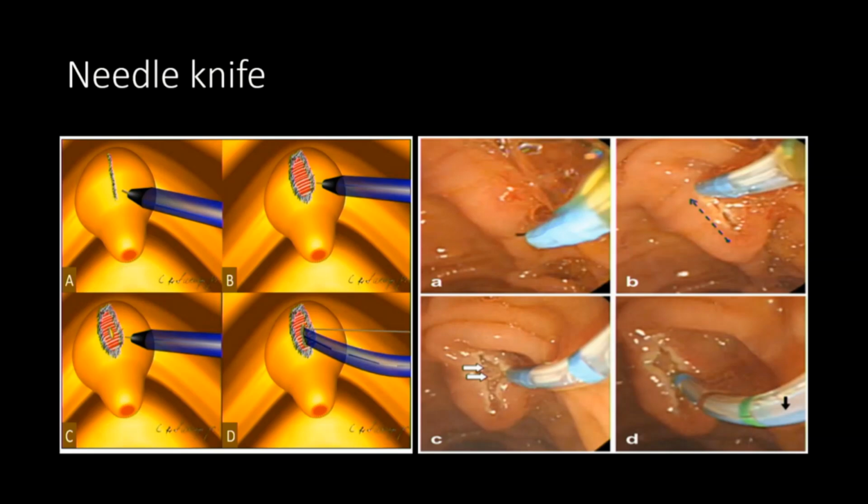One important thing that you should remember is that you should follow the same plane. This is something that we know from the surgeons. That means that you cannot dissect in one plane and then go in a lateral plane. You should dissect in the same plane. There are variations. There are the operators that prefer to dissect from up down, or the others that prefer to dissect from down up.